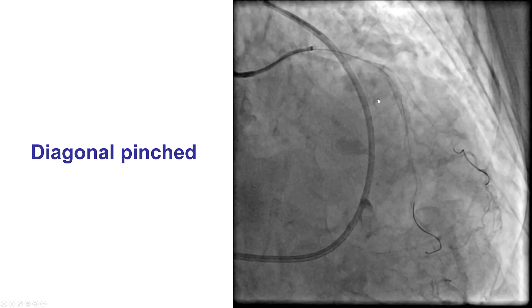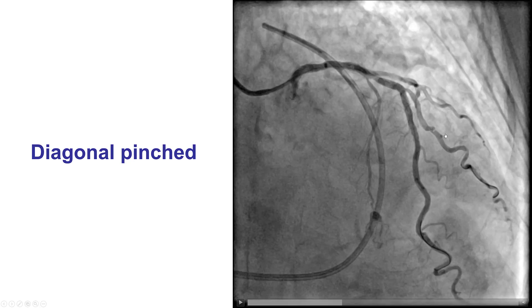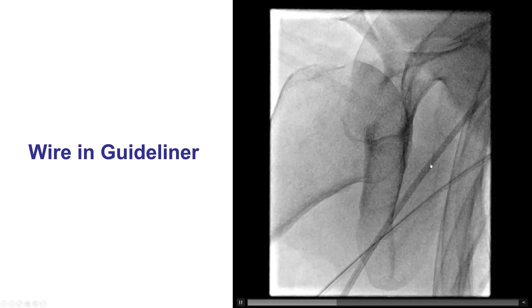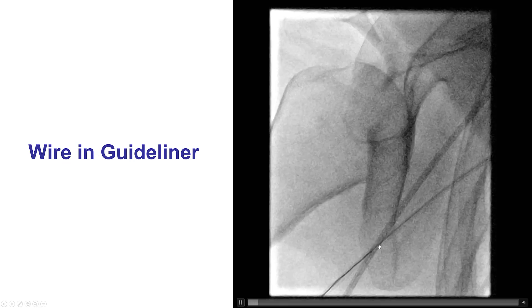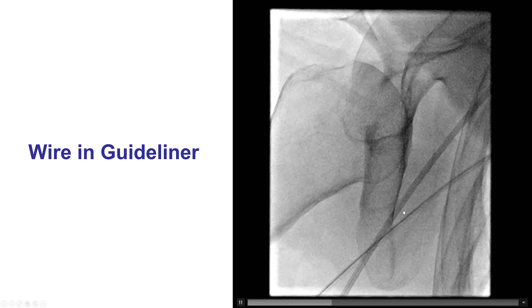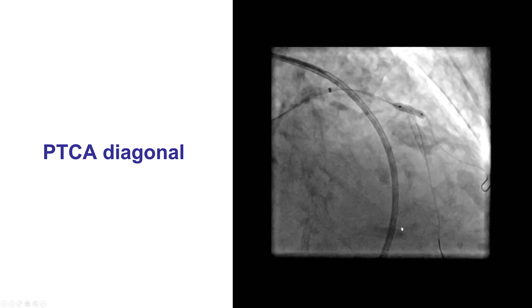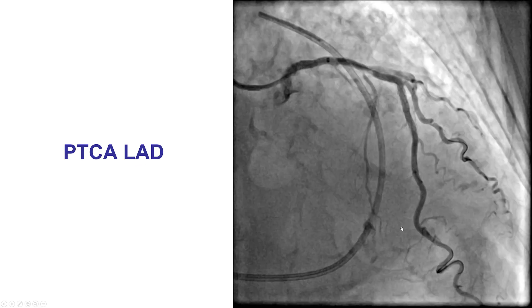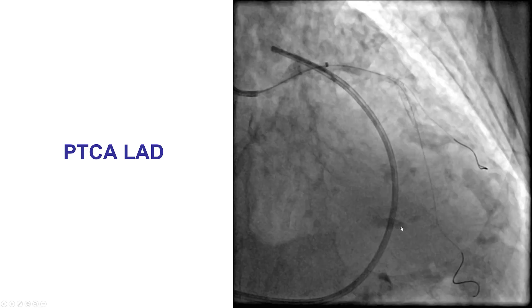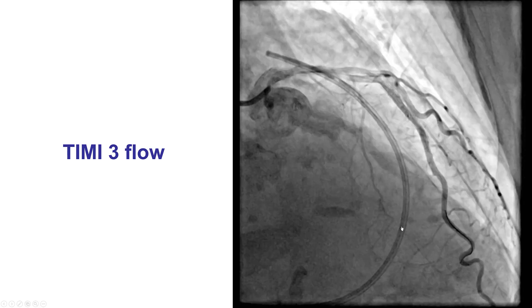That provided a nice result in the LAD, but we did have some stenosis at the origin of the diagonal branch. We can also see a pseudo-lesion in the diagonal, which is likely the result of straightening of the vessel from the guide wire — not of much concern. We tried to advance a second wire into the diagonal. An important caveat when using guide extensions is that it can be difficult to advance guide wires into the guide extension cylinder, and the wire can be deformed and damaged. Eventually we advanced it, performed balloon inflation in the diagonal followed by kissing balloon inflation, which provided a nice result with a DPR of 0.94 — no significant stenosis by coronary physiology.